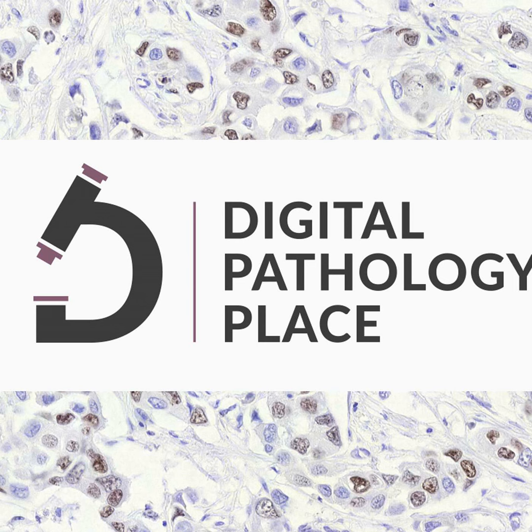correlation coefficient for AI-assisted review were generally higher than manual review, particularly for the percentage of sclerotic glomeruli. Does not surprise me at all, because we have a computer counting and a person counting. So we're not that great at counting.